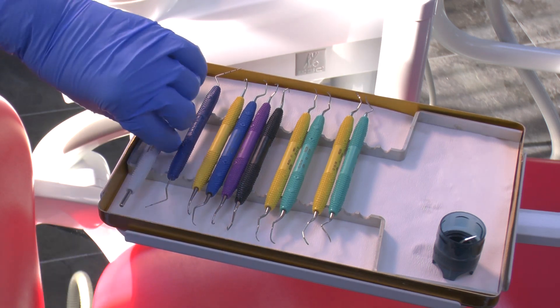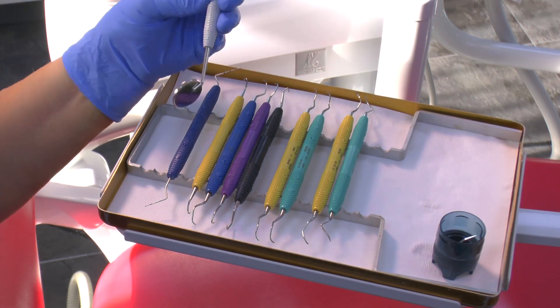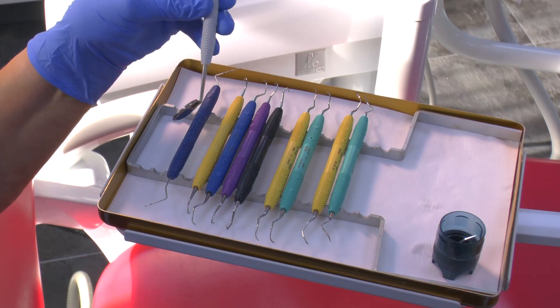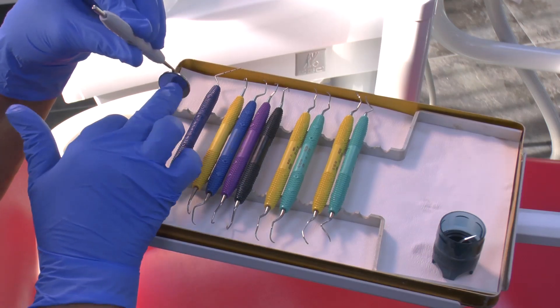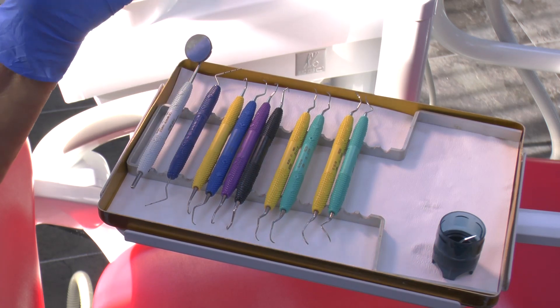The mirror is particularly nice. It's a size 5 and it's actually silvered not behind the glass but on the front, so you get much better reflection with this mirror than with a normal mirror that has the silver on the back of the glass. I feel it gives much brighter reflection.